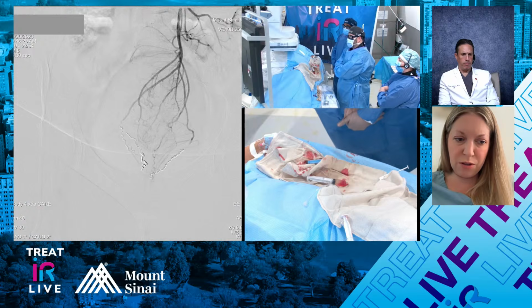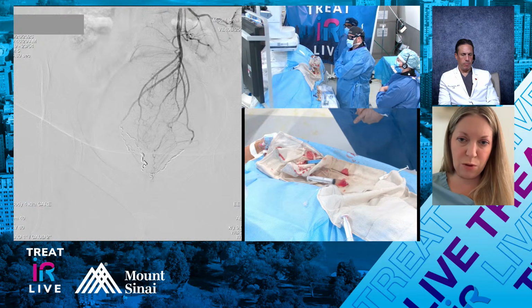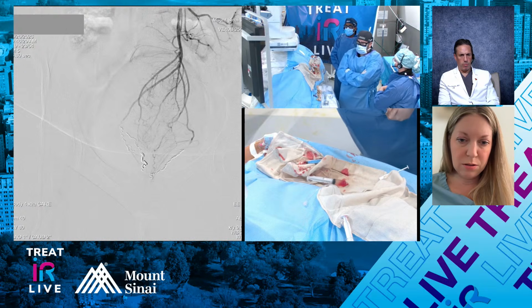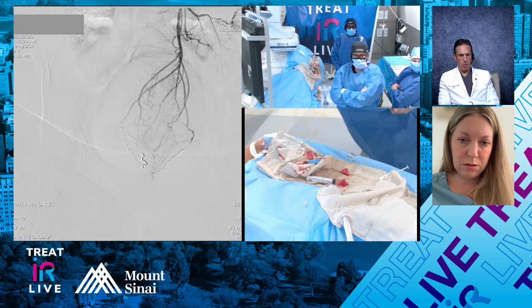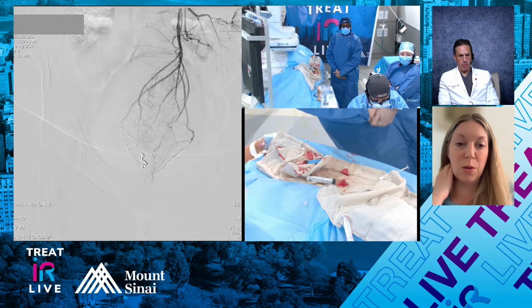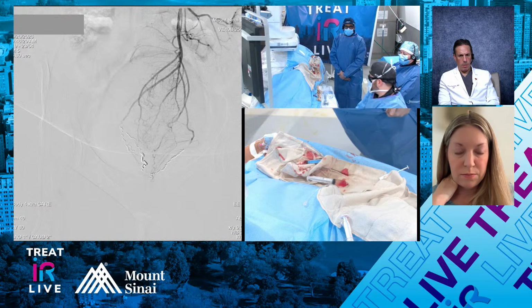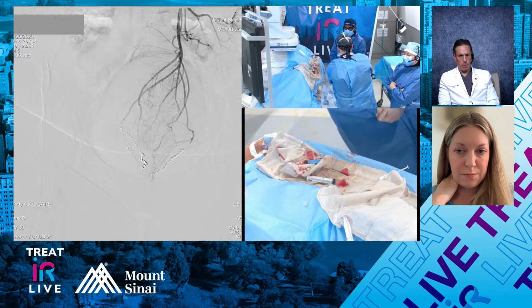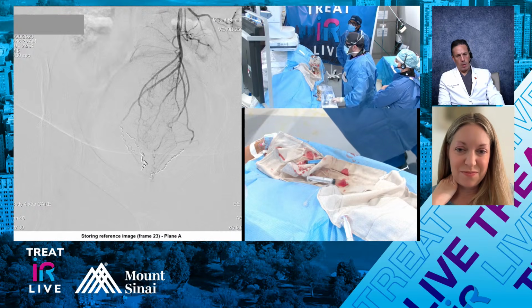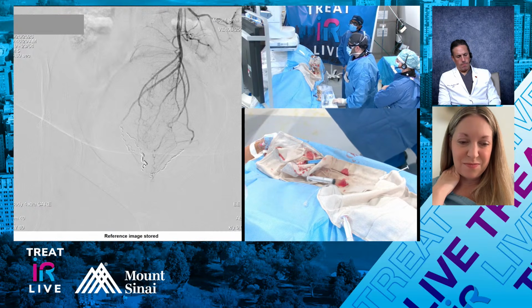Were you guys able to find the original run? I think when we de-identified, are you able to pull up the original run on the other screen? I just want to show that pretty area of blush where it was dropping down. Okay, yeah, we can show that. Give us a couple seconds and we'll pull that up. We can put this maybe as a reference for comparison. Are you able to see the reference on the screen?